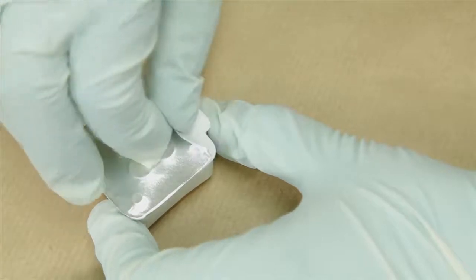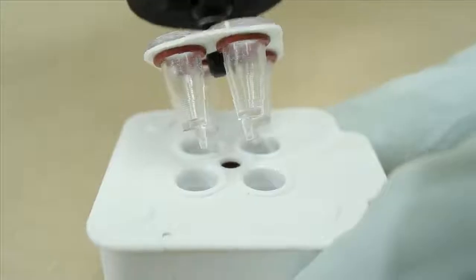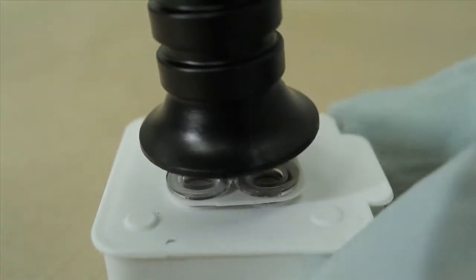The seal is removed from the reaction plate, which has been preloaded with chemistry. The sample collector is firmly inserted into the wells, and the handle is then snapped off.